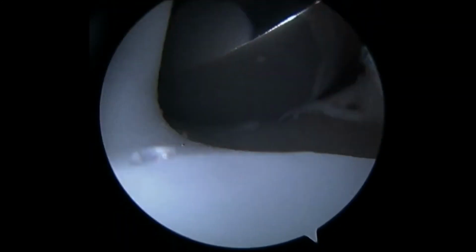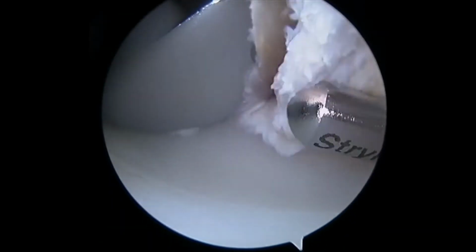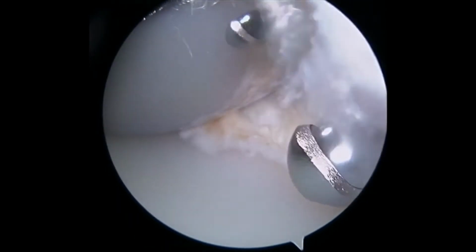So this is just now starting into the knee. What you're seeing here is the metal implant on the top and the plastic, the polyethylene, below on the tibia. And so you can see right there, there's a bunch of scar tissue. This tool is called a resector. It's an arthroscopic tool that removes tissue. So what we see sometimes on these knee replacements after they've been there for a while, some scar tissue can develop in between the joints, and so this is pretty typical on the inside. I don't think this part was necessarily causing her problem, but we always clean up everything we see.